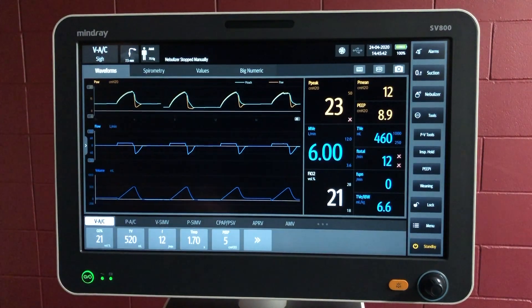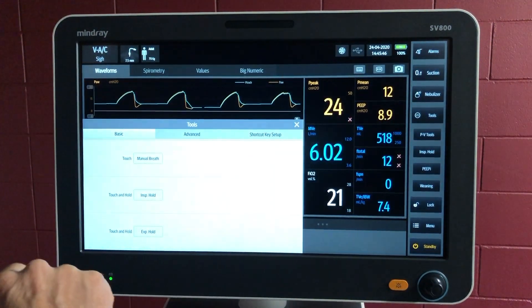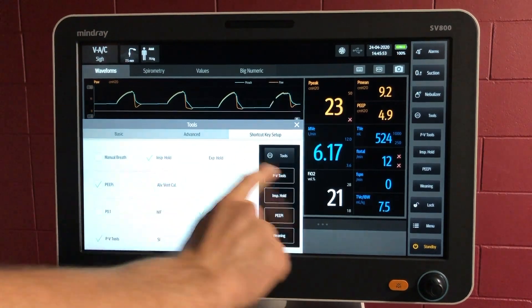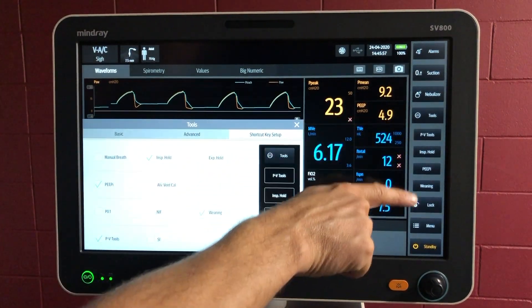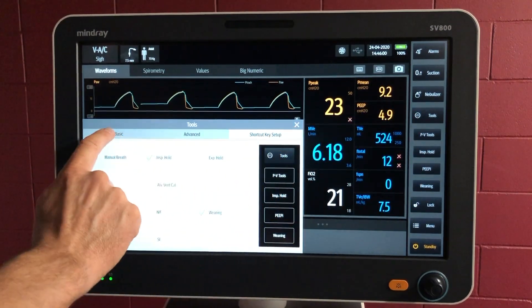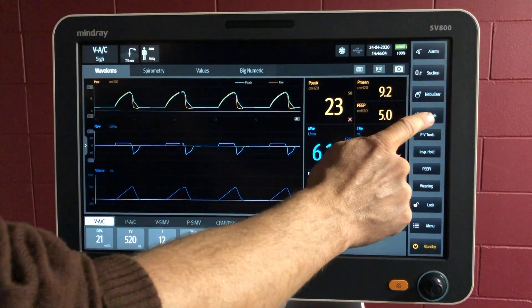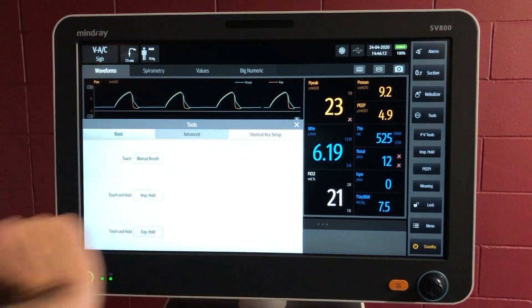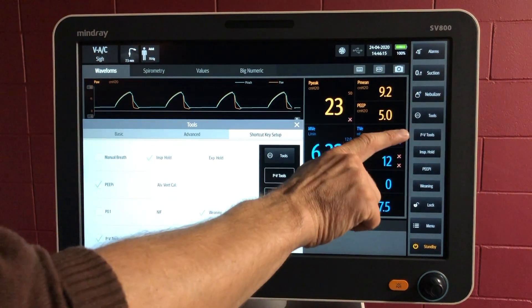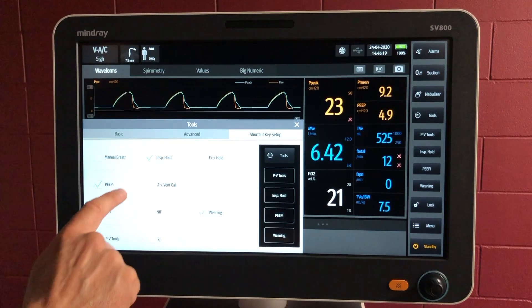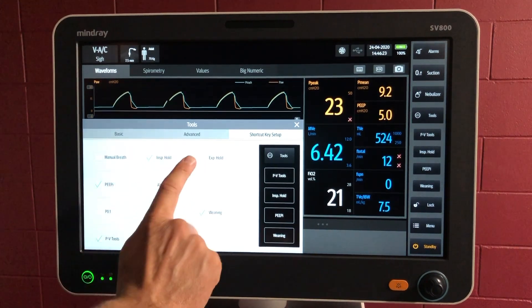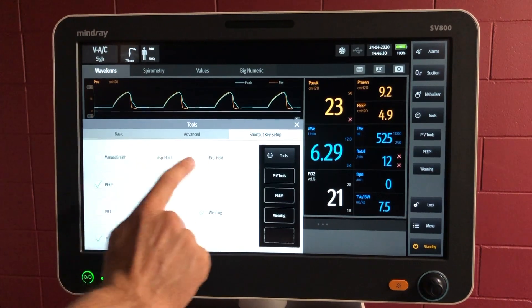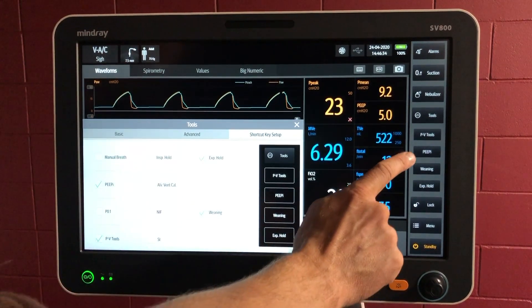Next up is your tools menu. You can pop here and have different tools available. You can also change the shortcut key setup for these buttons. Here are all the tools in this menu, and then we've got shortcut keys you choose on the right-hand side. We've got four available. If we want, instead of inspiratory hold, we want expiratory hold — if you just select it, it will say we can only have four tools at most. So you need to deselect inspiratory hold and select expiratory hold, and now the expiratory hold will be up here.